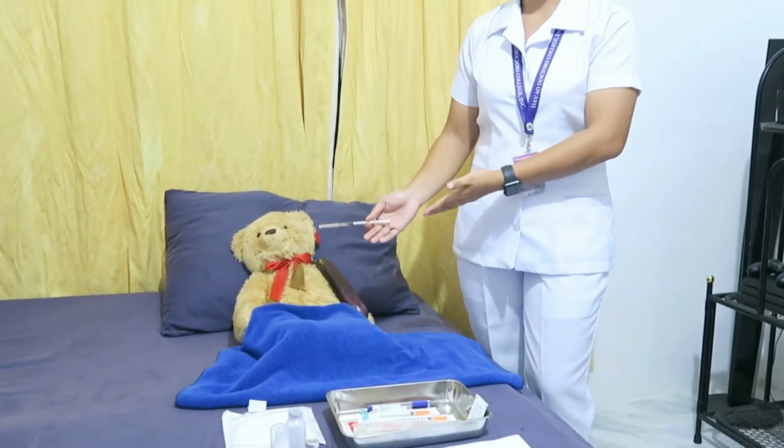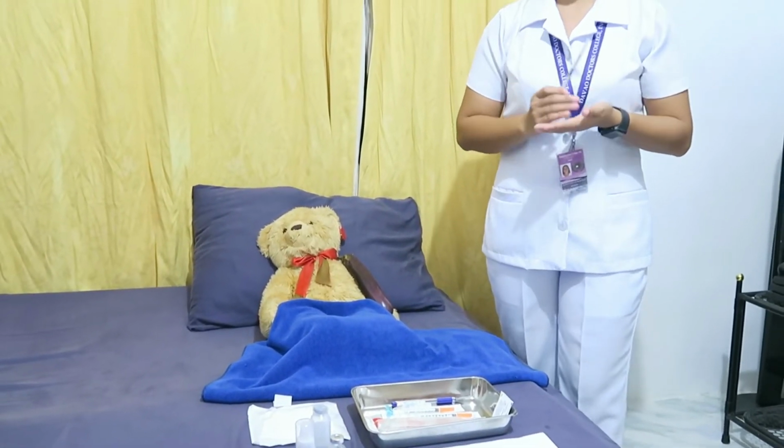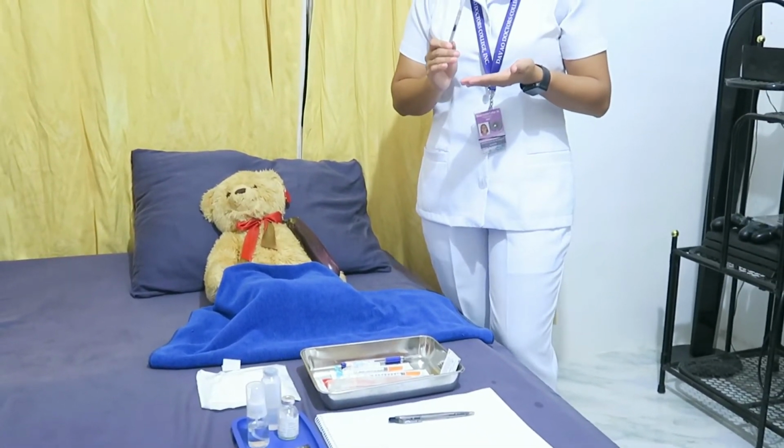So, the next procedure is to explain to the client that the medication will produce a small wheal, sometimes called a bleb. A wheal is a small raised area like a blister. So the client will feel a slight prick as the needle enters her skin.